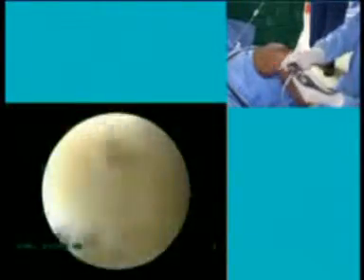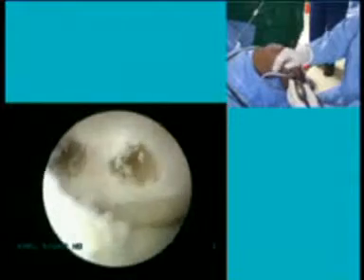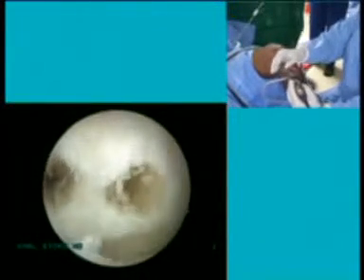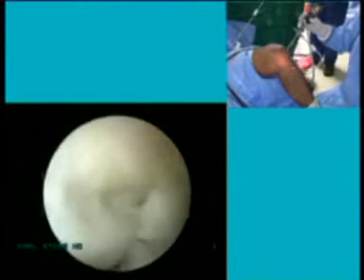It's hard to see from the medial side that these tunnels are divergent, but we take your word for it. The jig is designed in such a way that they are divergent. The aimer gives you a divergent direction of the tunnel.